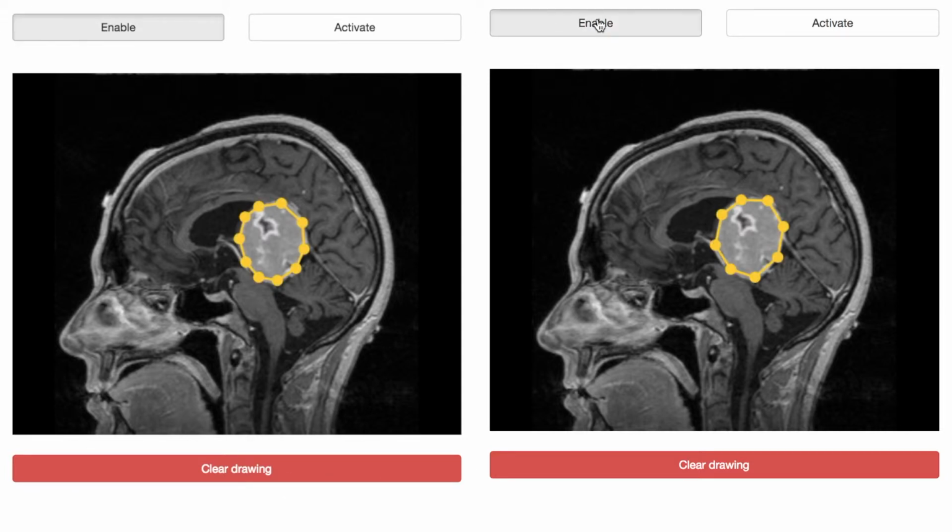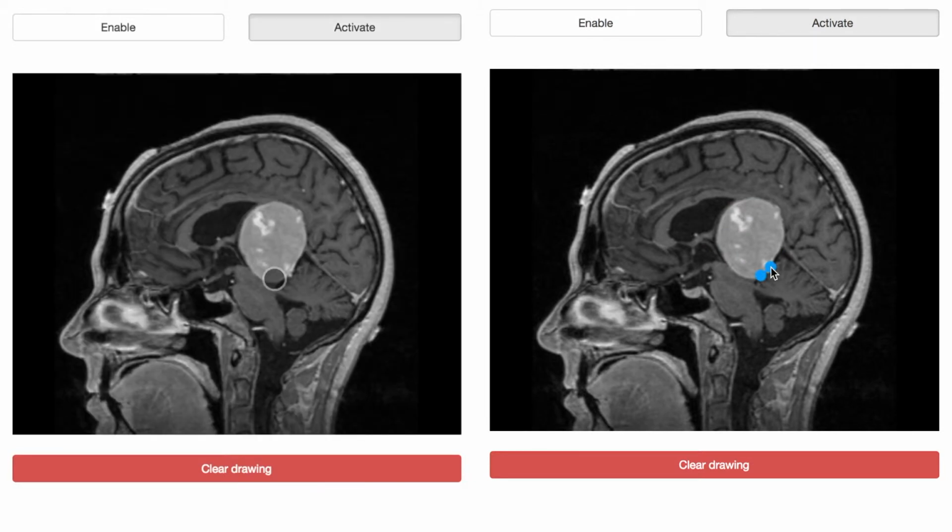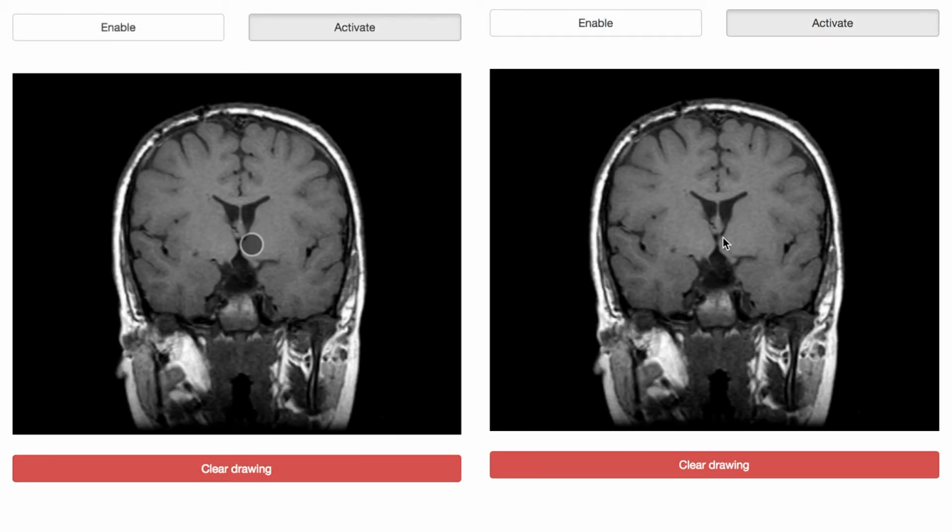Three of the five radiologists used in the test have shown that the touch environment is better classified than the traditional environment. Although we must consider and understand the other two radiologists' results. Responses to the final questionnaire suggest that both interactions are adequate for analyzing medical images. Moreover, no radiologist reported discomfort, dizziness, or fatigue in either environment.